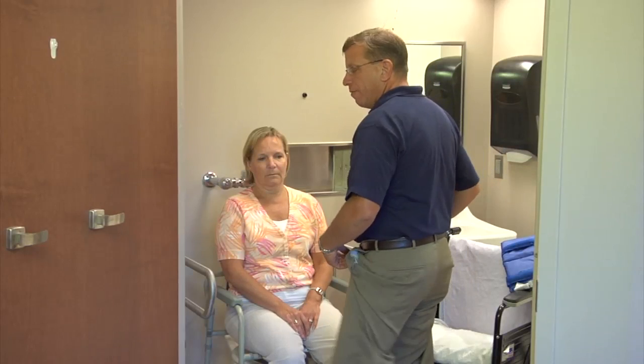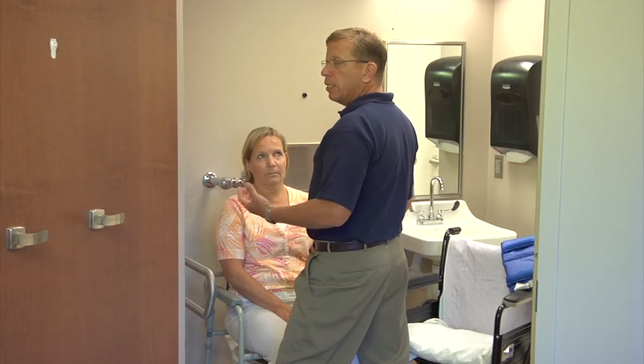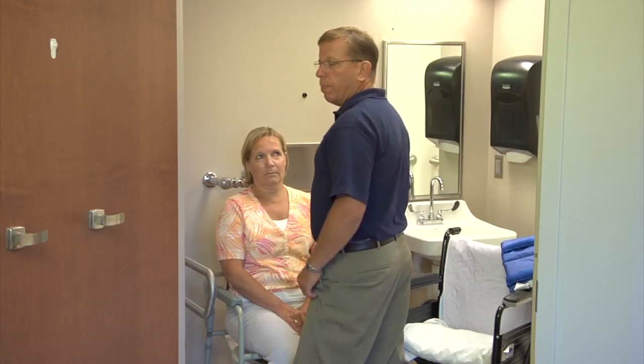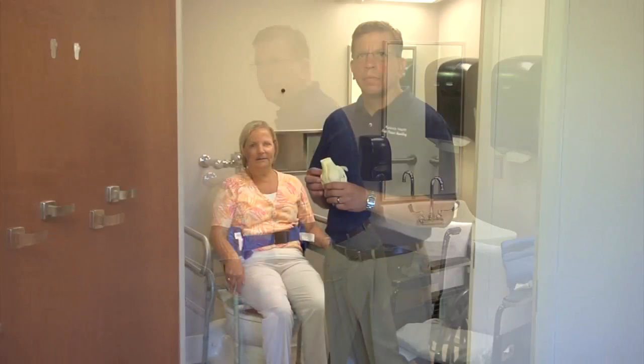In looking at this particular transfer, the healthcare worker cannot get very close to the patient resident. In fact, it's hard for them to maintain the curve in their lower back, getting close enough for this transfer. Therefore, they put their back in a very compromised or awkward posture.